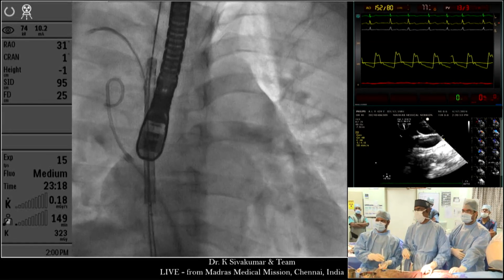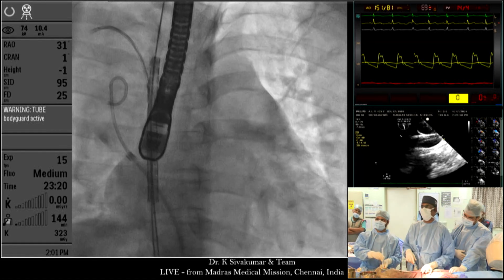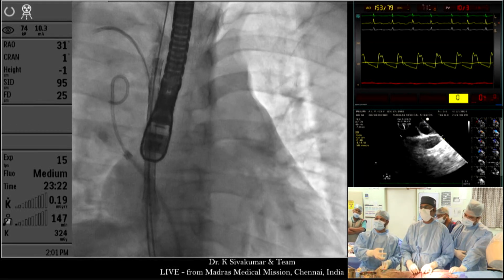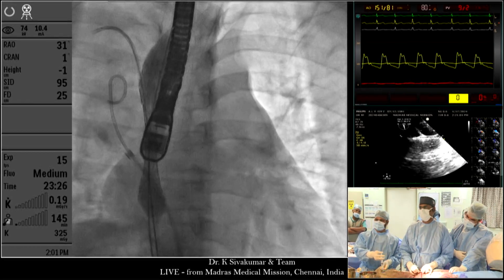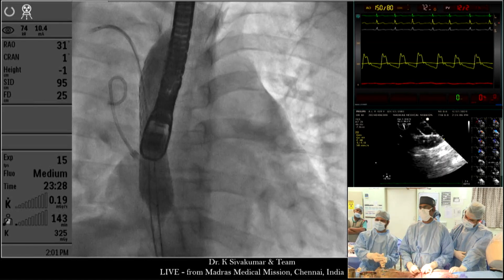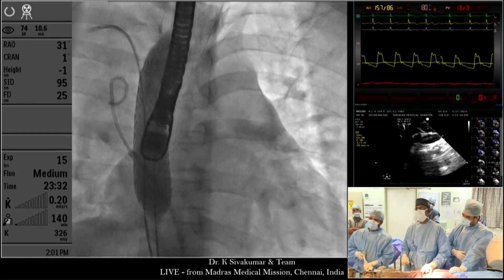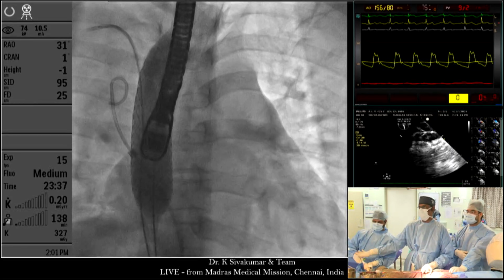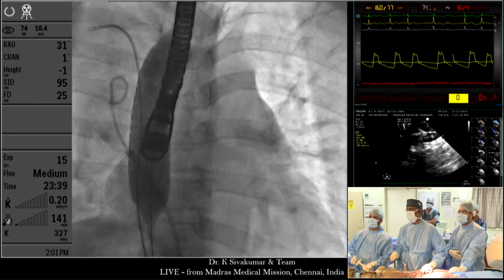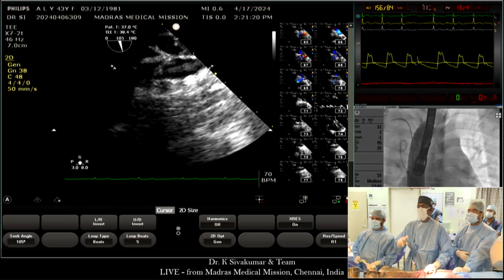Okay. Now you are ready. Now Pramod is going to inflate. Keep inflating. Go to around 3 atmospheres. Tejasvi, now make the transesophageal bigger, and now show the color flow.